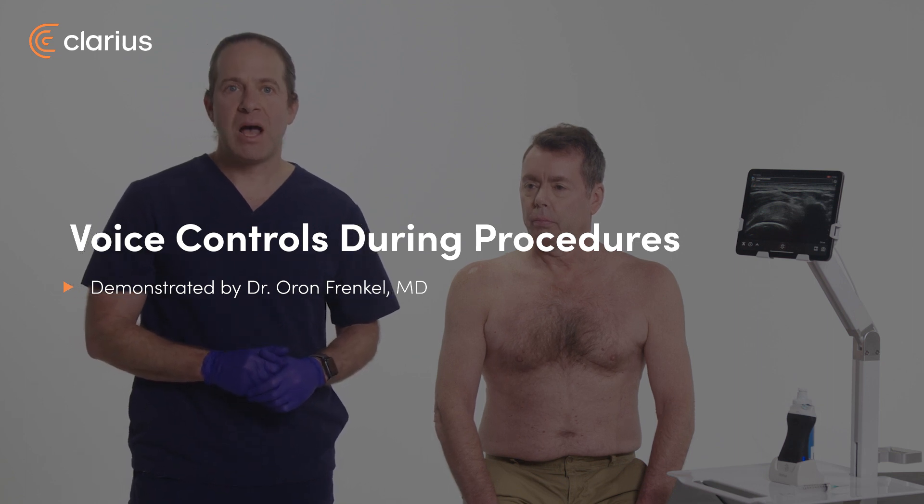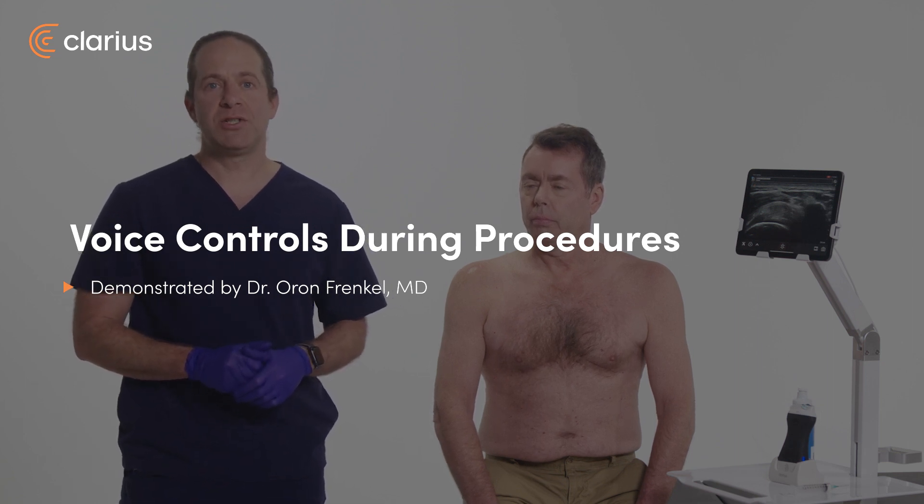I'm Oran Frankel, an emergency physician. I'm going to show you how to go hands-free during your next ultrasound-guided procedure with new Clarius voice control features.